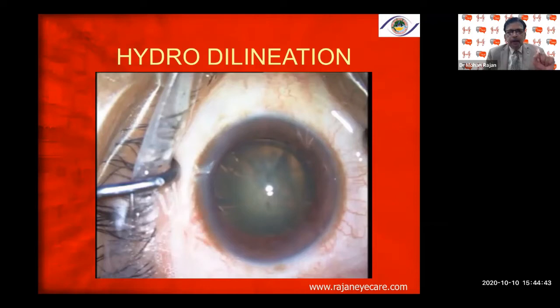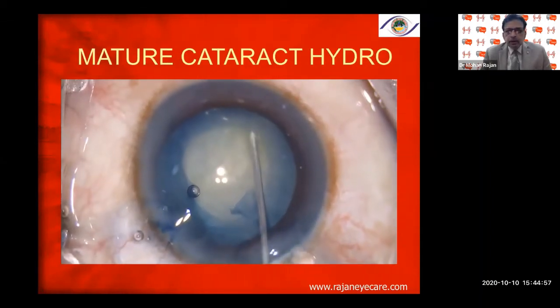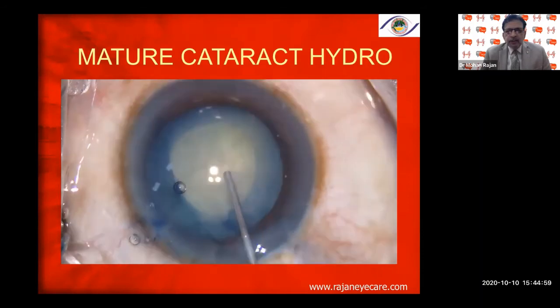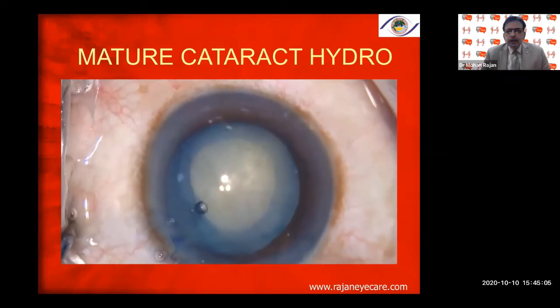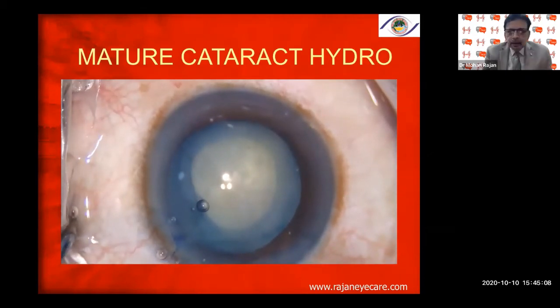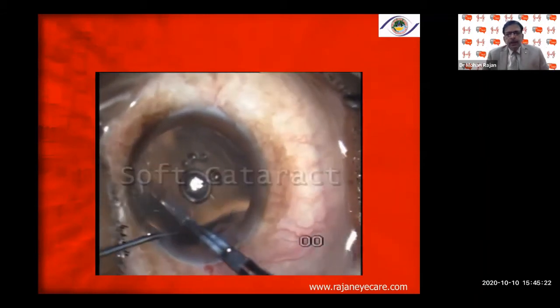In very dense cataracts, be careful with hydrodissection — you can do hydrodelineation instead. In a mature cataract, you don't need much hydrodissection because there is good separation already. Always perform a very gentle hydrodissection — sometimes there can be an underlying posterior polar cataract, and sometimes you do not see the wave. Do not be aggressive with hydrodissection in soft cataracts.